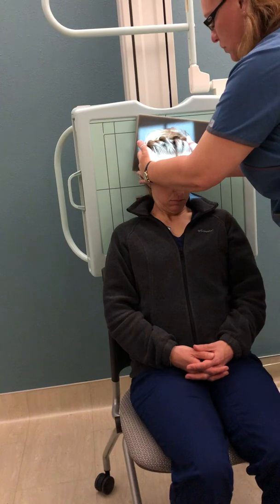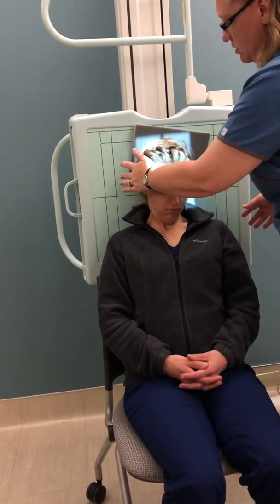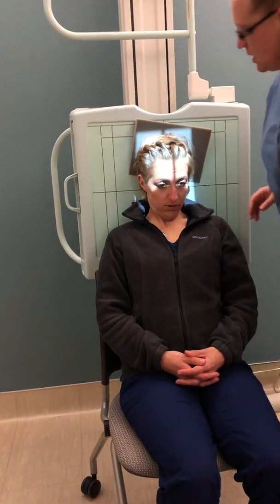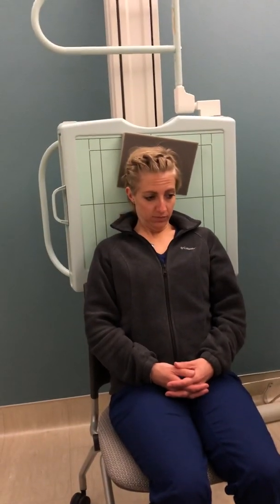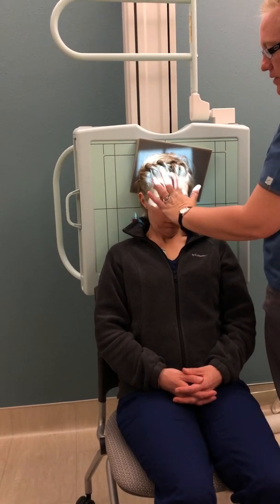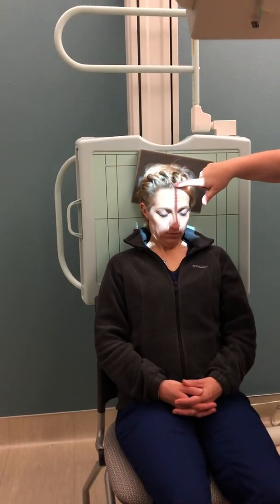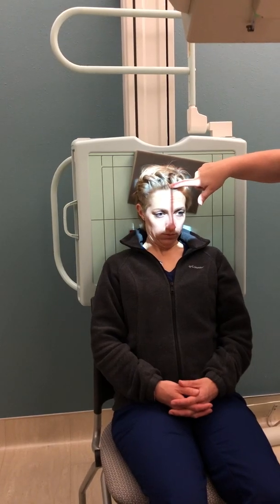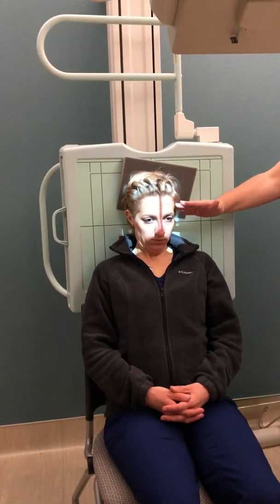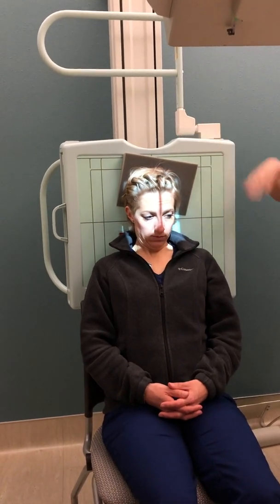We want the mid sagittal plane. I'm going to enter two and a half inches above the top of the glabella. Right here is going to be my entering point, which is just slightly into her hairline. It should pass through the EAM on each side.